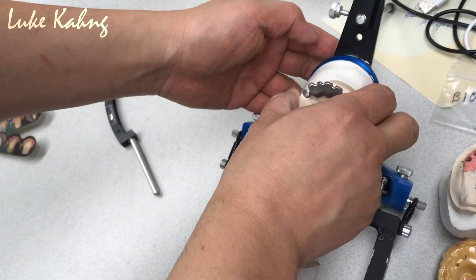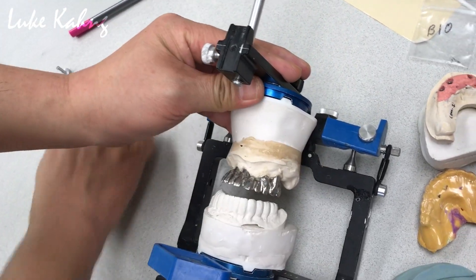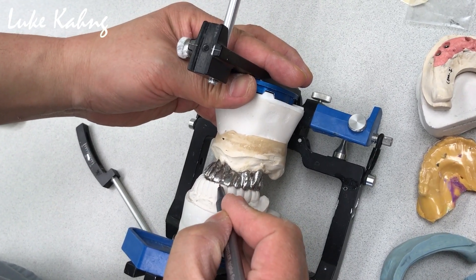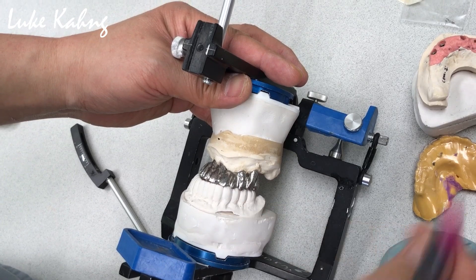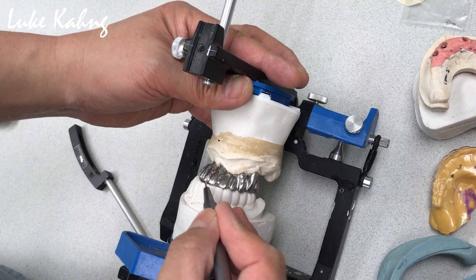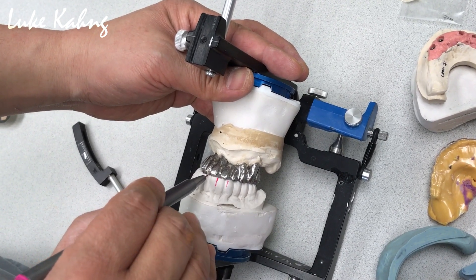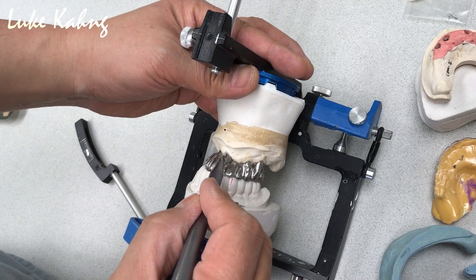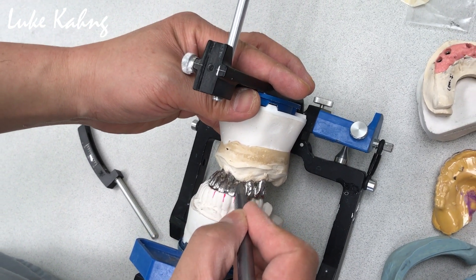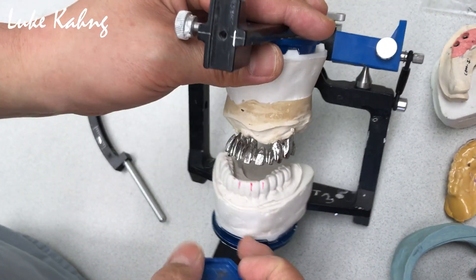Elvin asked me the question: is this good? We already set it up. So the midline — did you set up the midline? Correct it. And then same line, which is same shade, same size of the tooth. I like the gingival tissue. I think we have to add a little bit more here, and then we can make the same alignment.